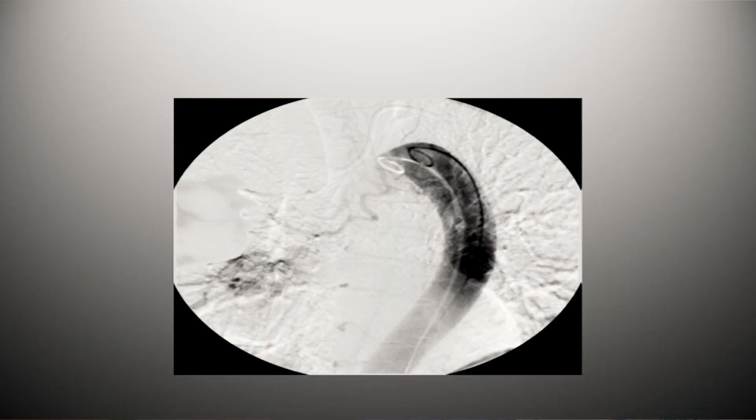So as you can see, the bronchial arteries are small to begin with, and now they are feeding into a field which is constantly moving. Even under anesthesia you can't stop breathing. You can slow it down, but you can't stop it altogether. So there is always some motion artifact.